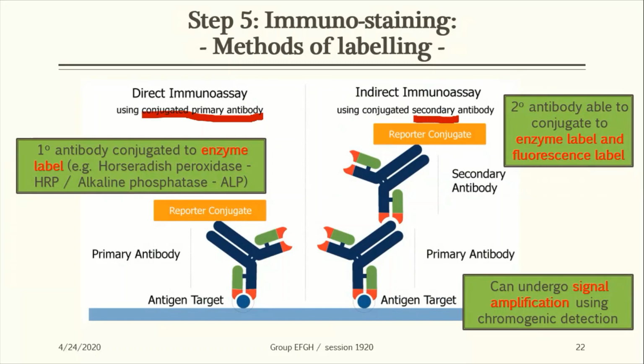In simple words, the primary antibody that binds to the target antigen is conjugated, which is linked with an enzyme.